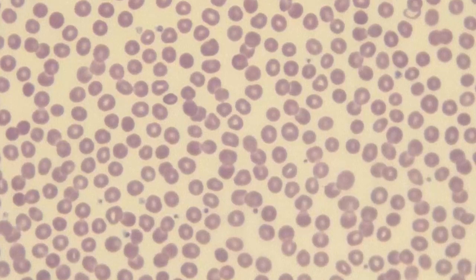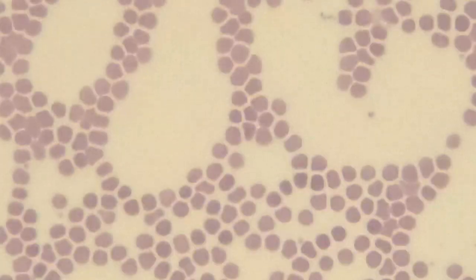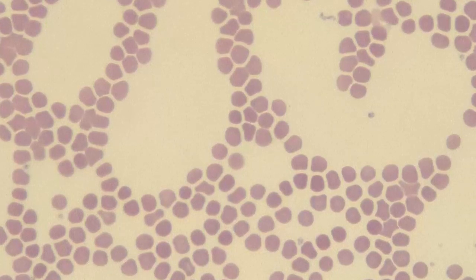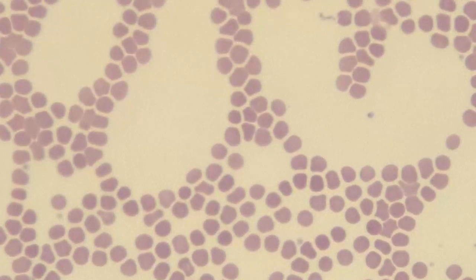Now, to show you the contrast, if we go out to the edge, you can see here how the red cells take on the shape of each other, and there are big gaps in between them. One of the things that you'll notice is that these red cells don't have any central pallor. So this is really not a good place to start a differential.